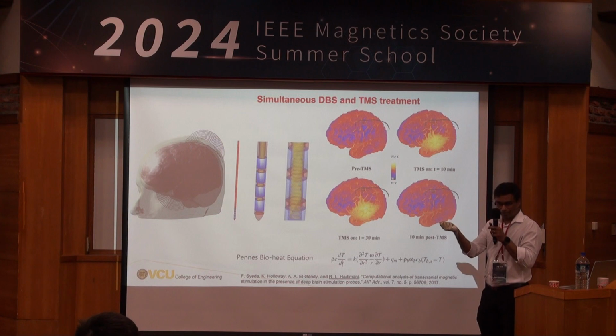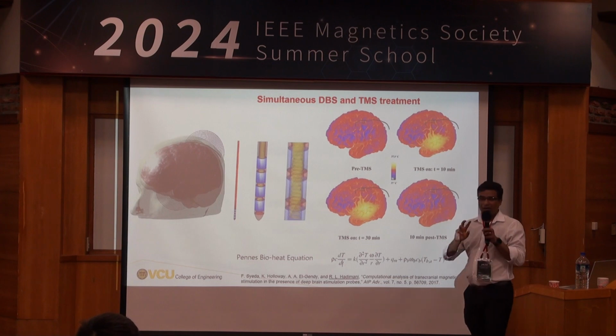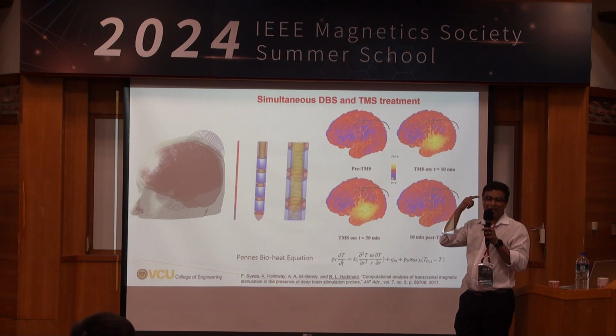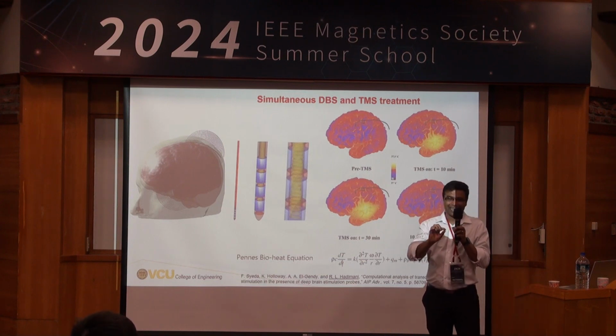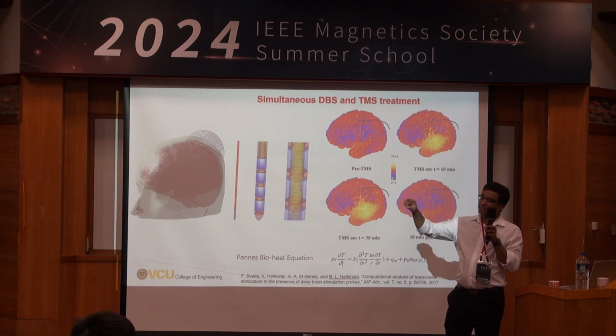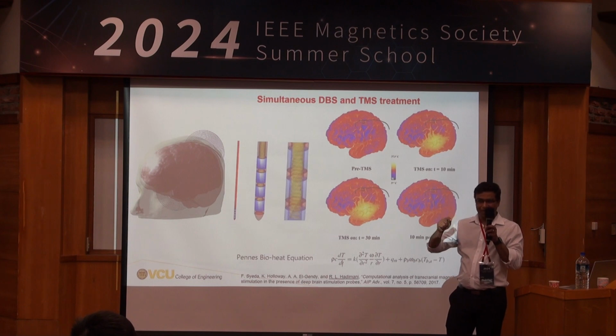They ask the patient to move different parts of the body, and the neurosurgeons, they know how each neuron fires, so they literally connect the DBS lead that they are inserting to a speaker. So when the neurons fire, you can hear the firing pattern.